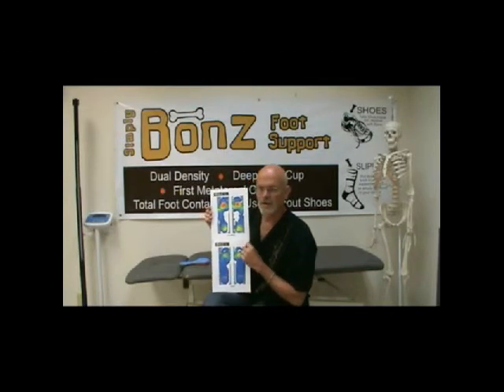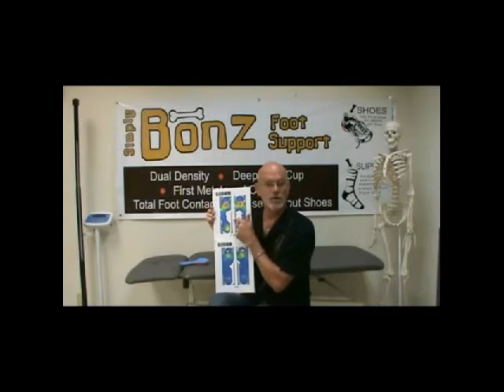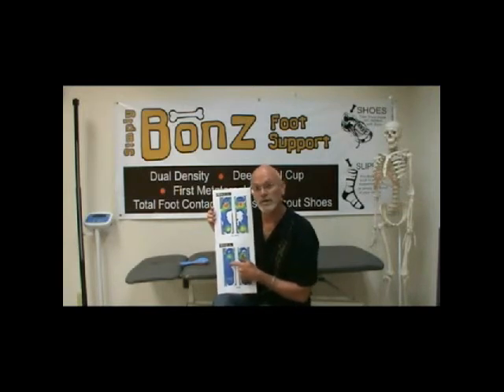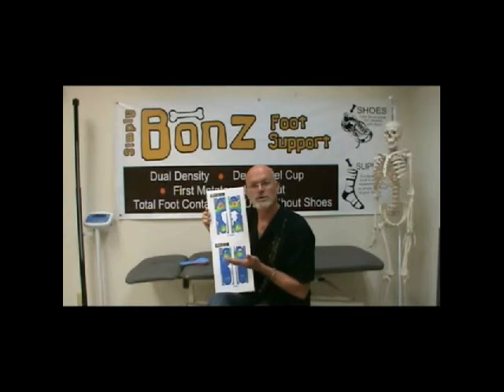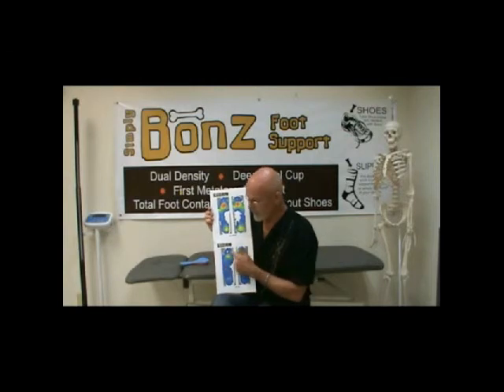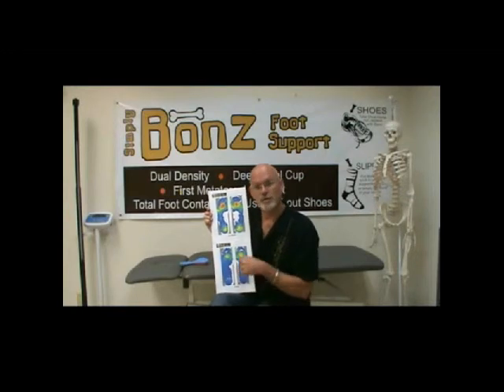But if you look at it a little bit more closely, the reason for that is that you've got all this white right here, okay? This is the part of the arch that when a person's wearing their shoes is not contacting anything. So there's no force distribution under the arch itself. With the bones, that white area is eliminated on this side and greatly reduced on this side. In other words, we're adding force to the arch itself. Well, remember, pressure is force divided by area. So if we get more area that we're contacting, then the pressure is going to go down.